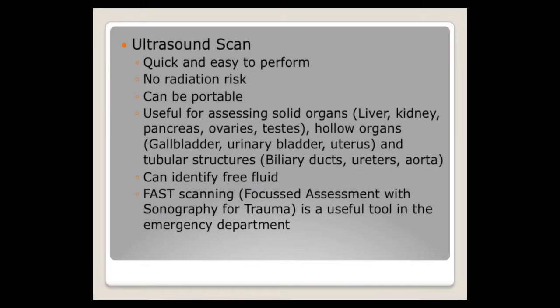Ultrasound is a very useful imaging technique for a number of reasons. Firstly, it is quick and easy to perform, and it has the benefit of not exposing the patient to any radiation. It can also be portable and performed on the ward, and is useful for assessing solid organs such as the liver, the kidneys, the pancreas, the ovaries, and the testes. It is also useful in the assessment of hollow organs such as the gallbladder, the urinary bladder and the uterus, and also tubular structures such as the biliary ducts and the aorta.